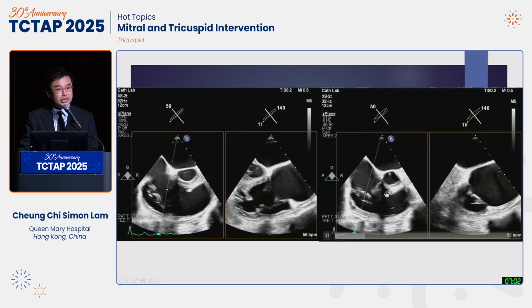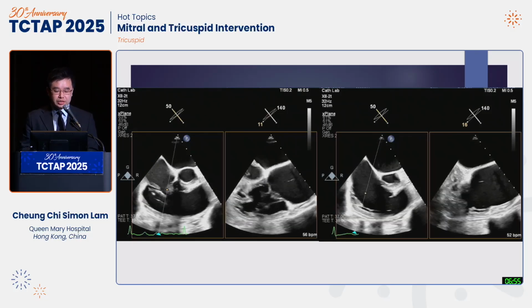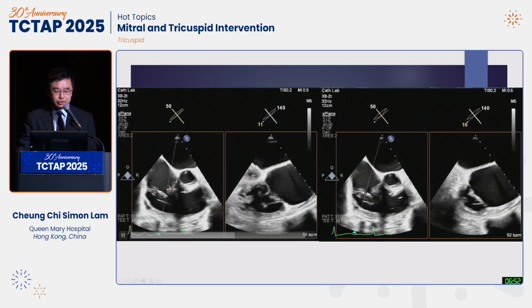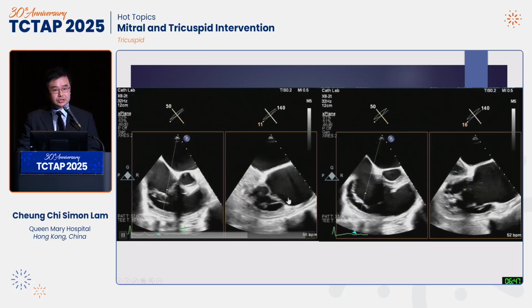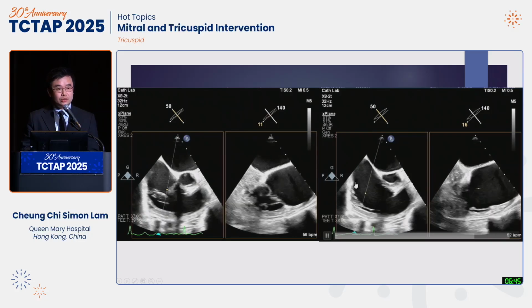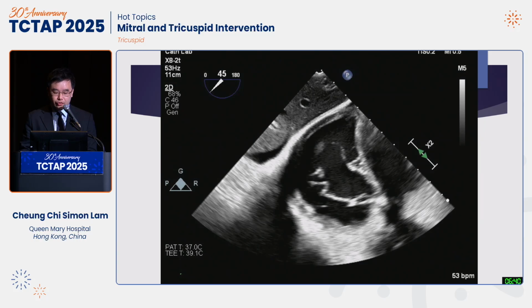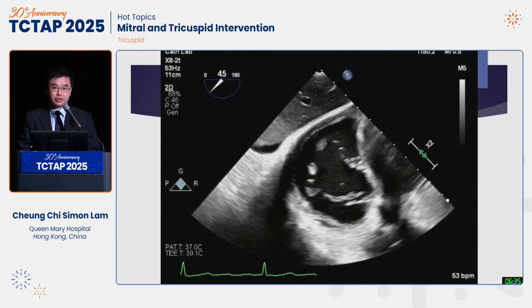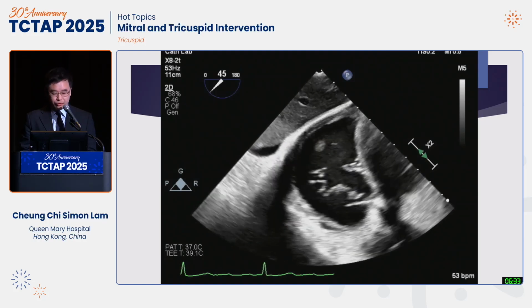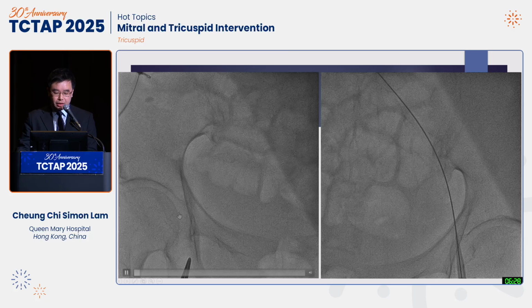And we need to do imaging. TEE is the standard of care. We have to get the inflow-outflow view with the X-plane showing the relative relationship. For example, if you do the X-plane near the aorta in this region, you can separate the septal and anterior leaflets. If you put it more to the side, you will separate the septal and posterior leaflets. So you need to know the target that you're focusing on. This is a very important view, the transgastric view for tricuspid regurgitation for TEER, because it helps with your leaflet grasping as well. Sometimes we confirm it through this image view.